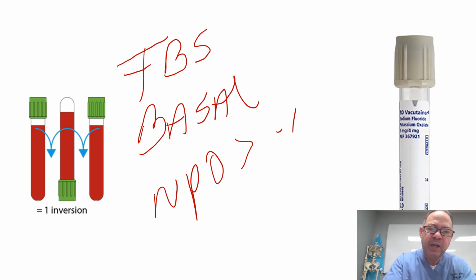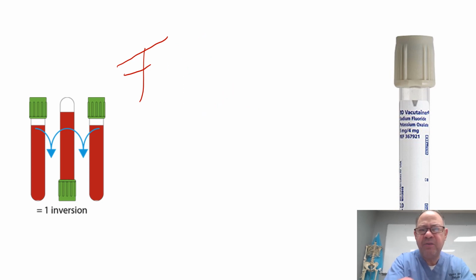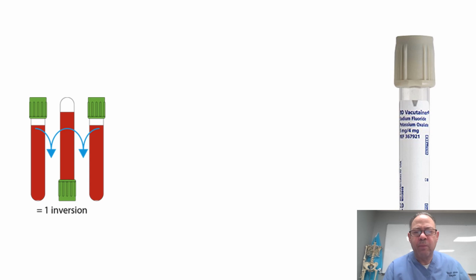So the patient has to be in a fasting or in a basal state, basically for glucose, for cardiac marker, for lipid marker. If I just want to know how's your red blood cells, your white blood cells, your platelet, you don't need to be fasting, okay? That's an unnecessary risk.